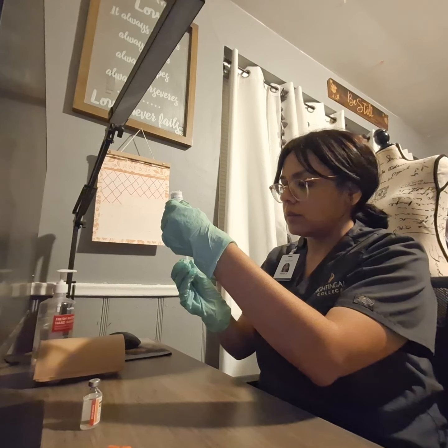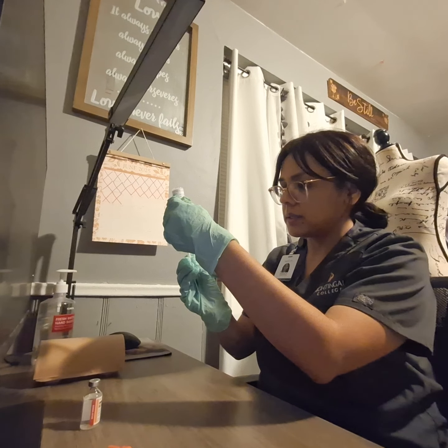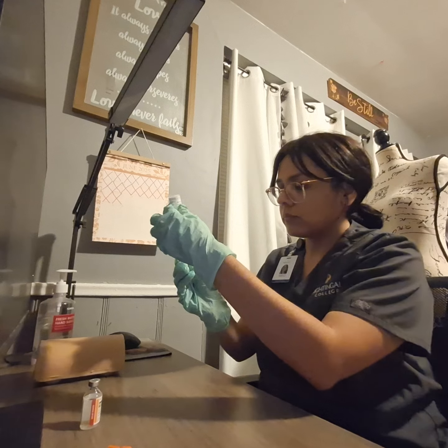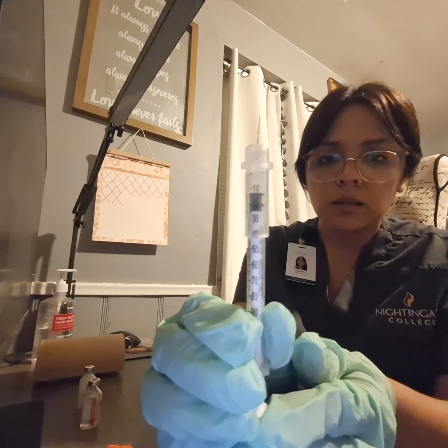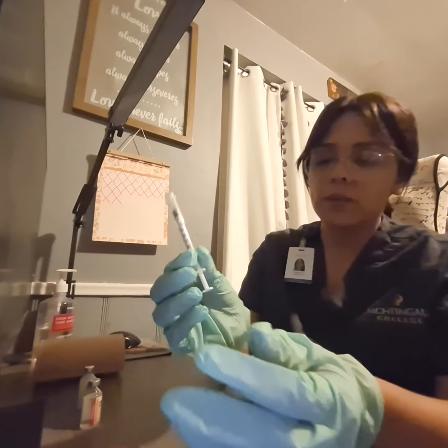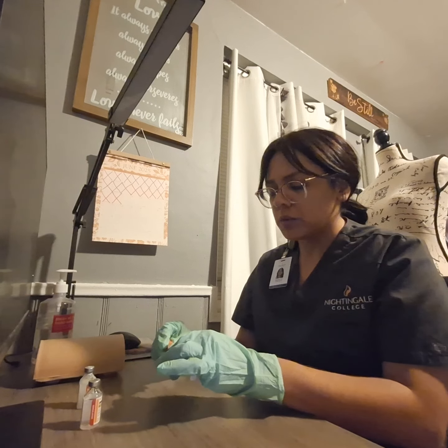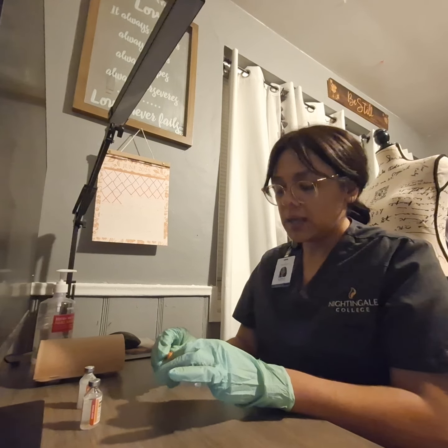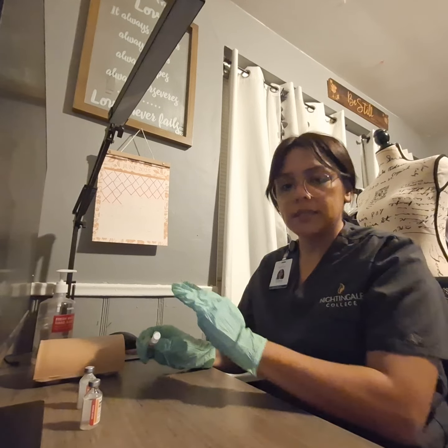And here I'll verify that I have 12 units. And I'll be doing this slowly, again, being careful not to overdraw. Right. So then we got the 12 units here. And if I prepare this away from my patient, I'll go ahead and cap this carefully. I'll label the syringe with our medication name and our dose. And I'll go ahead and administer that to Mrs. Garcia, my patient.